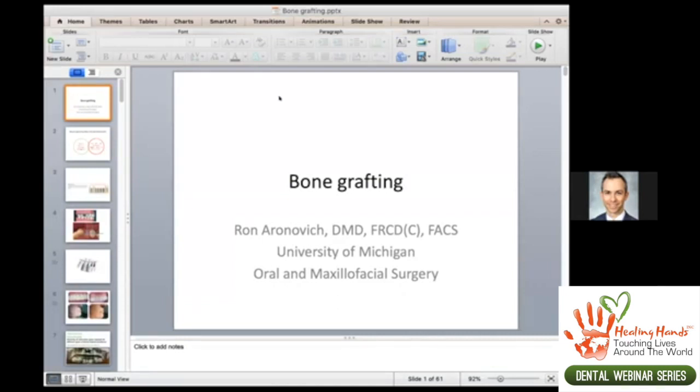There's another question here: which is better, natural bone graft or synthetic one? And that certainly depends case to case. If you're performing a ridge preservation graft where you have a low likelihood of problems, and you have a lot of surrounding progenitor bone cells and good surrounding blood supply, then a synthetic bone graft like an alloplast could work very well.